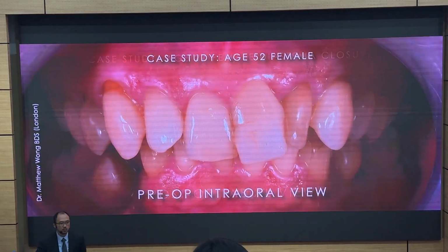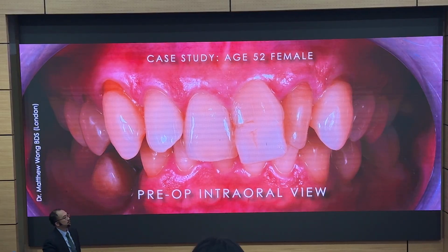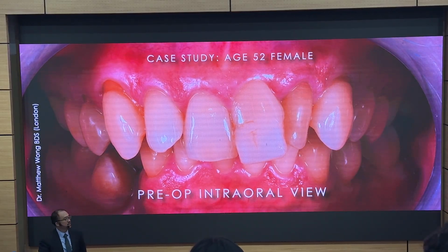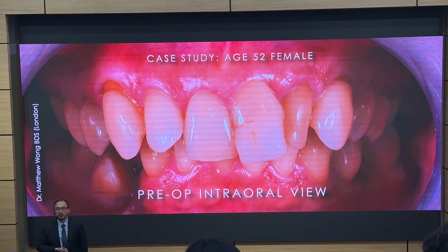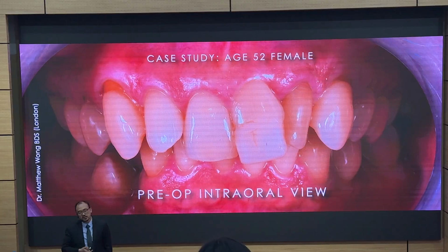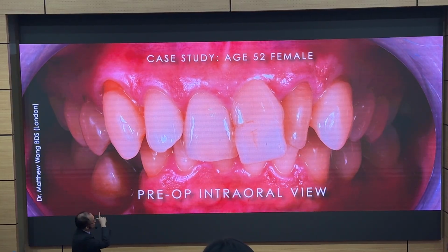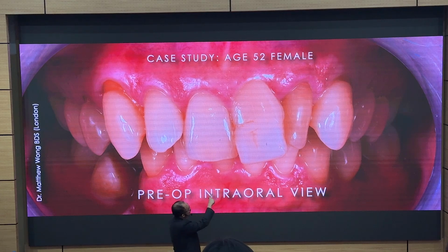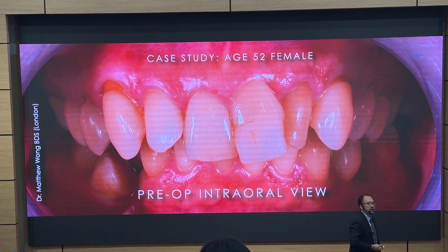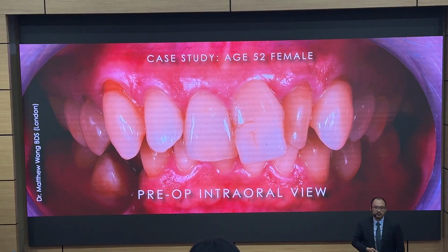Now, let's look at one more mistake I made. This is Rita. She's a very scary woman. This sort of case is hard because it's not like the previous case where the teeth are very, very well aligned. So for this case, what did we do? In order for me to restore, her request is don't touch any other teeth, only fix that one. Okay? So in order for me to do something, I have to go back to what I taught you a while ago, the direct mock-up method.